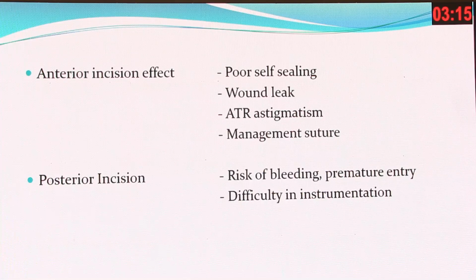And if the incision is anterior, it will cause poor sealing, wound leak and ATR astigmatism. The management is only to put sutures. One should not feel shy about applying a suture in such cases. If the incision is posterior, there is a risk of bleeding, premature entry, and difficulty in instrumentation.